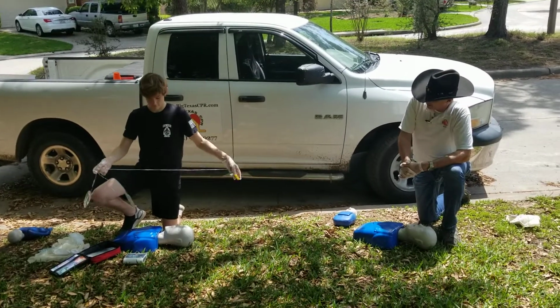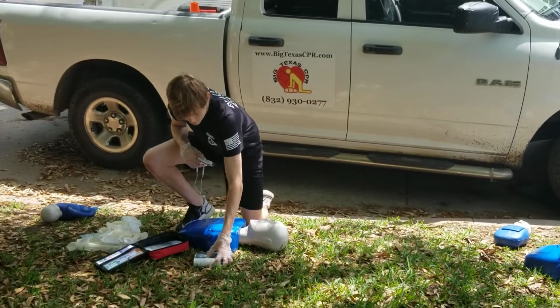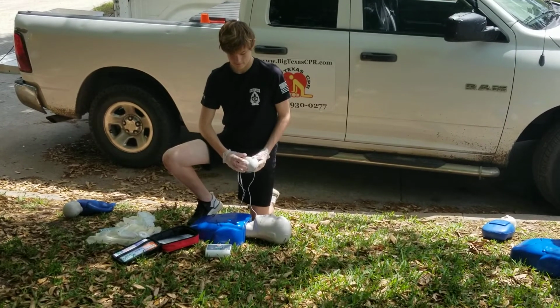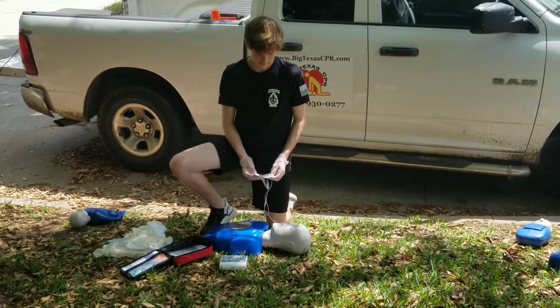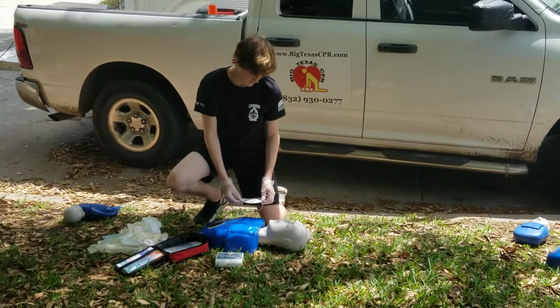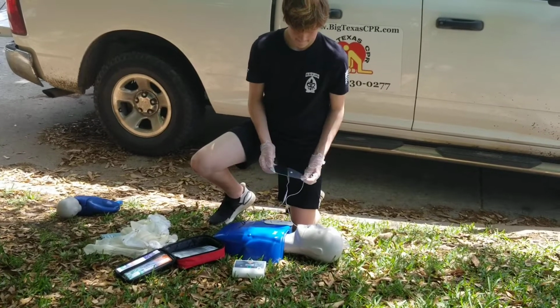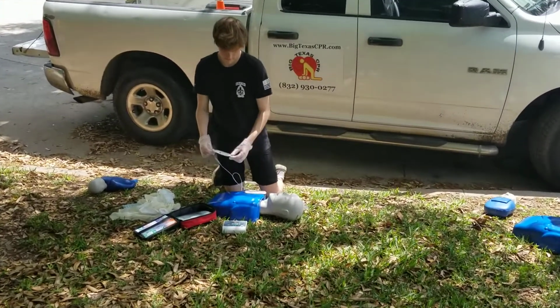But before you plug it in, go ahead and turn it on. You have to press it harder. Just wait. There you go. Apply pads to patient's bare chest. Plug in pads connector next to flashing light. And go ahead and do that. Apply pads, plug in connector.